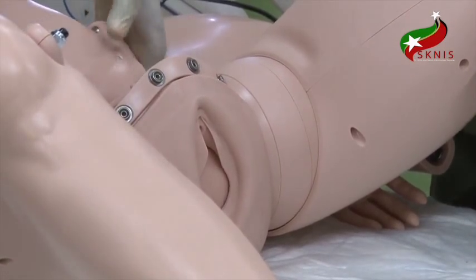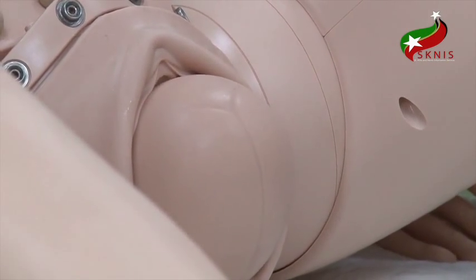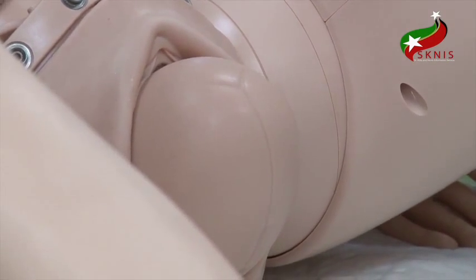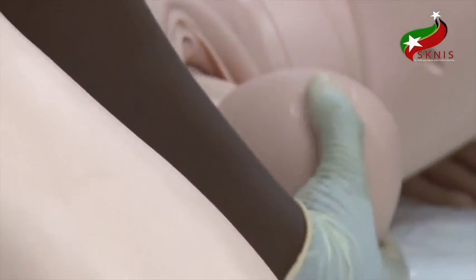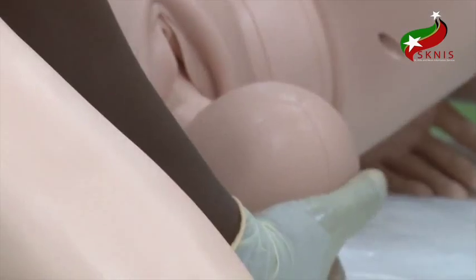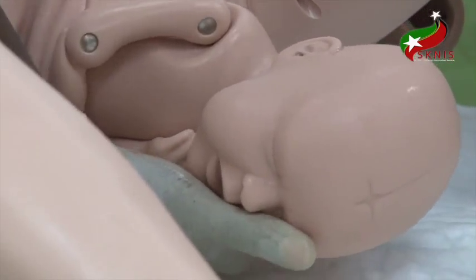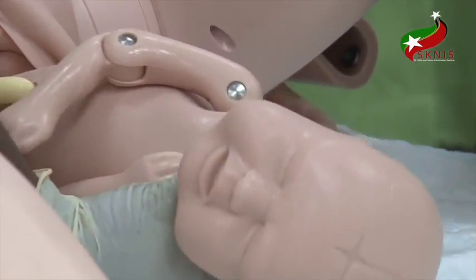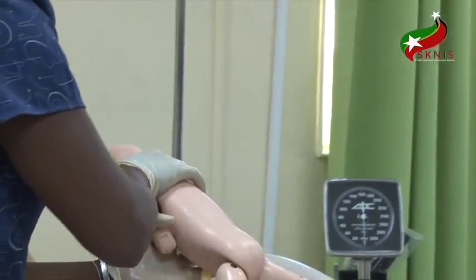in the occiput anterior, the fetus flexes and the head pushes forward, and you see the back of the head first. The baby's head comes through the vaginal orifice, and this is why it's the occiput anterior. You see it first. We gradually turn, rotate, deliver the shoulder. And then you have a normal delivery. But Sim Mom has the capabilities to deliver the baby herself.